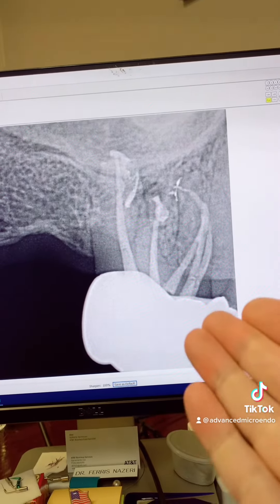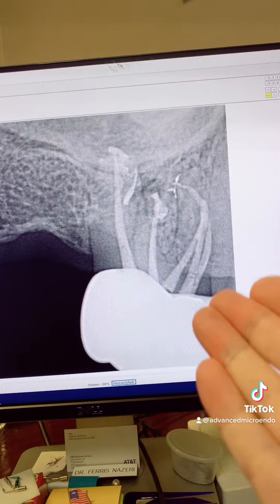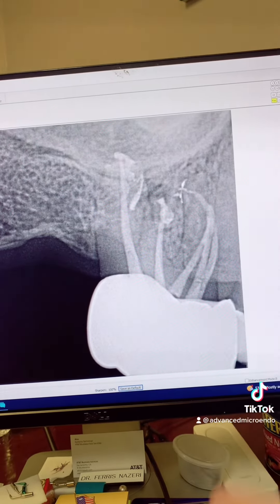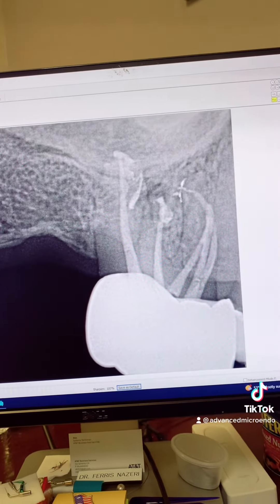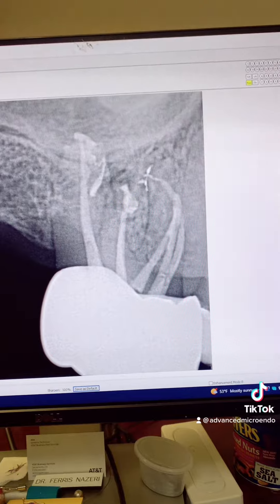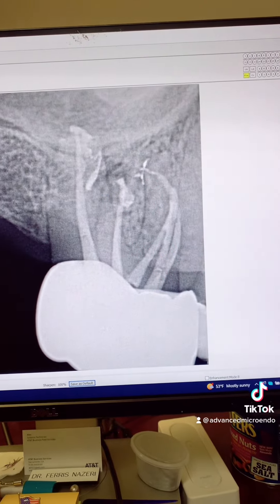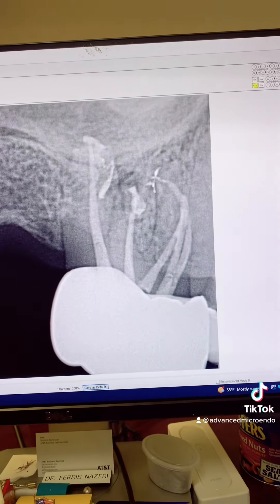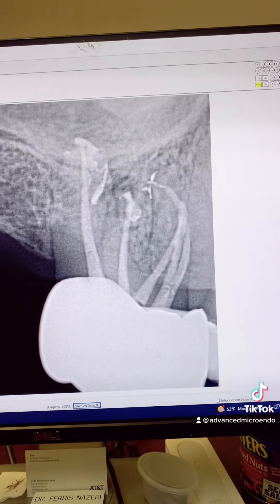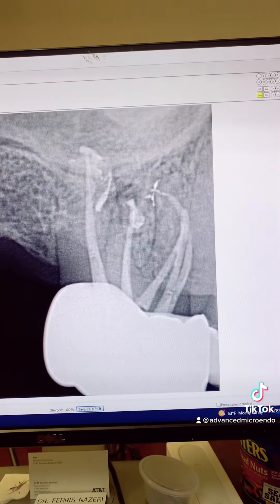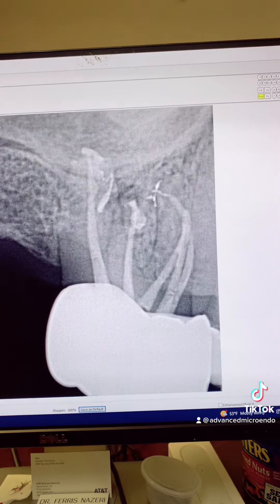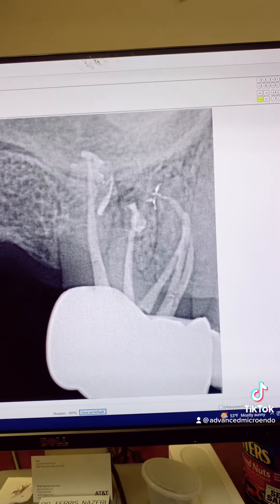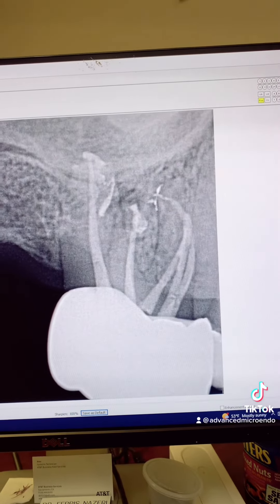But don't settle for just MB1 and MB2 — there might be an MB3, like here in this case. Everything went great. As you can see, we temporized the tooth and referred the patient back to his dentist for the permanent restoration. There's so much anatomy here.